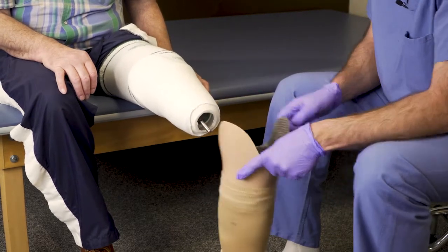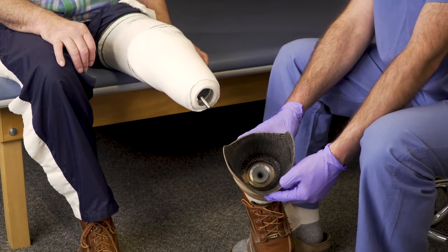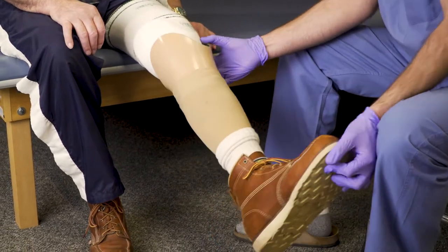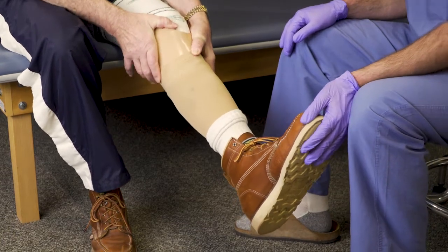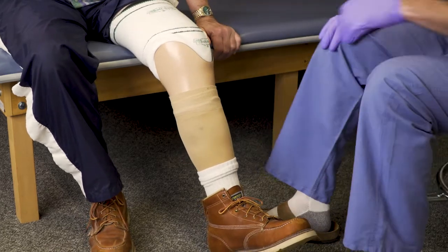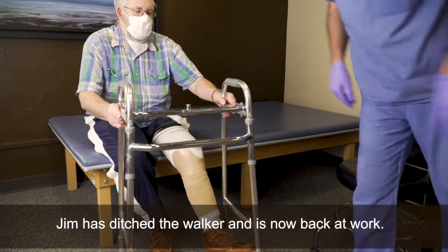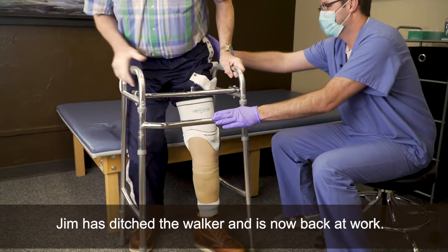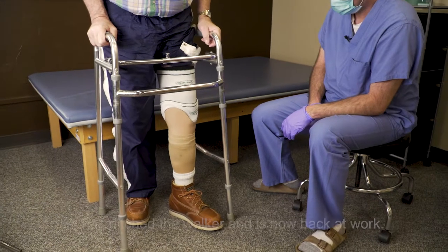Have that centered, and then in the bottom of the prosthetic, there's a lock that grabs that pin. So rather than a suction or a vacuum, this one's more of a mechanical suspension. There we go. You heard it go in. We're just going to push down real quick. Okay, when it clicks. Now I'm going to grab your walker real quick so I can have you stand up, okay? So hopefully we can get rid of that soon. Find out Wednesday. All right. And we're all the way down.